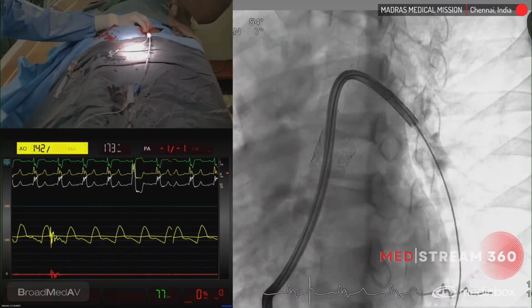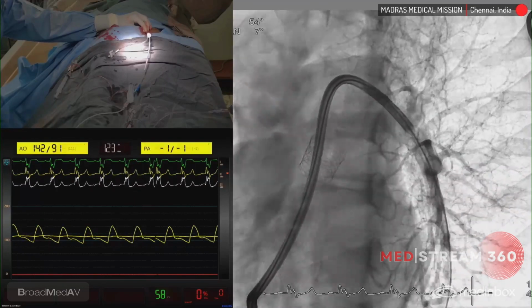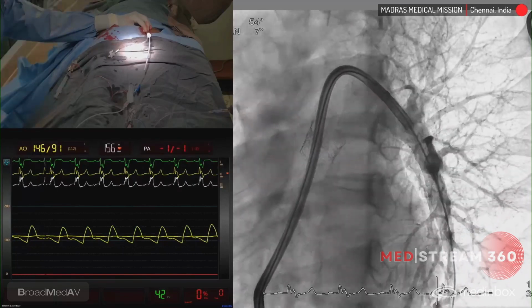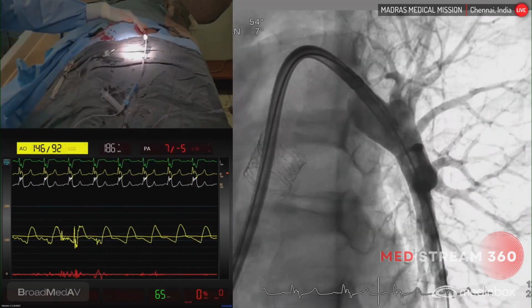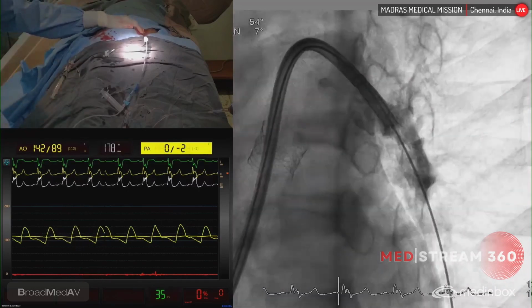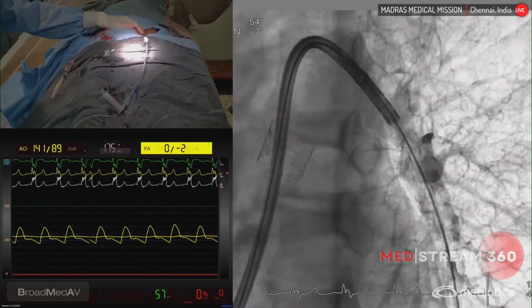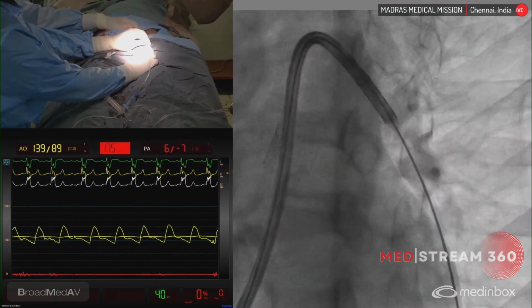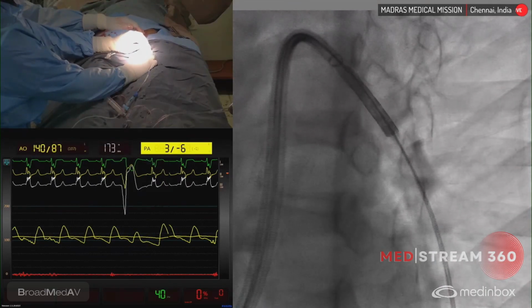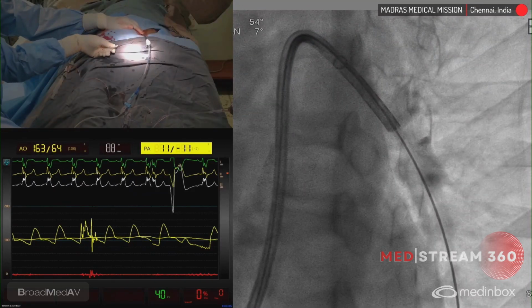The position looks fine because we're able to see that discrete stenosis. Can you give one mag here? Zoom that. Yeah, position it now. I think that discrete LPA narrowing at the origin, we are positioned well. Yes, sir. So if I am able to peel back the sheath, you are ready for an inflation, correct? Yes, sir. So I'm just going to peel back the sheath. At this point, one more angiography.